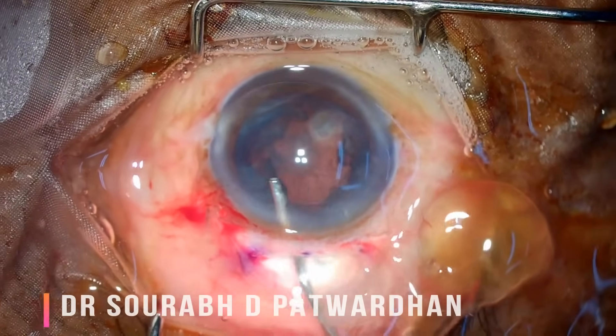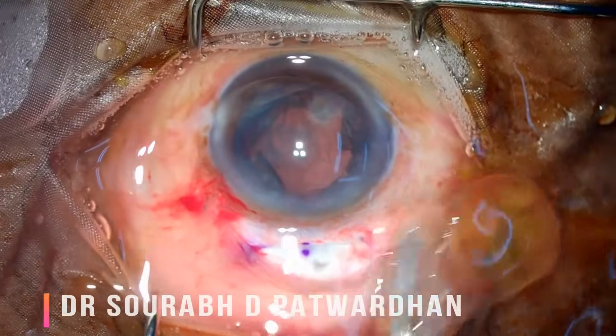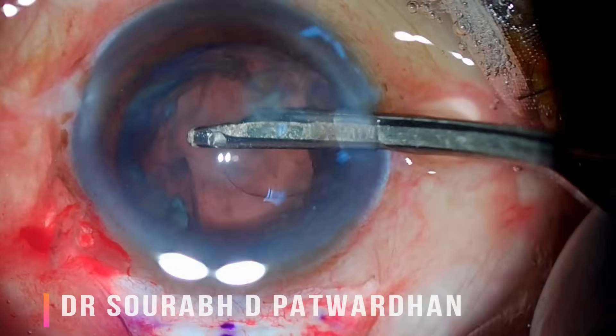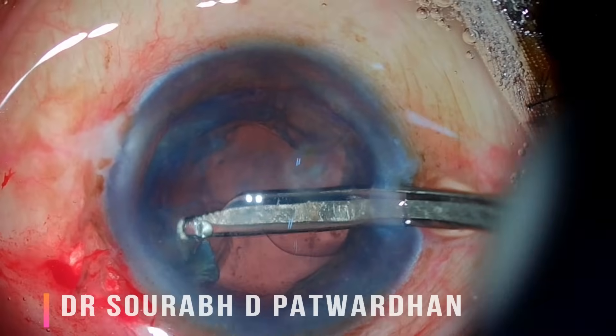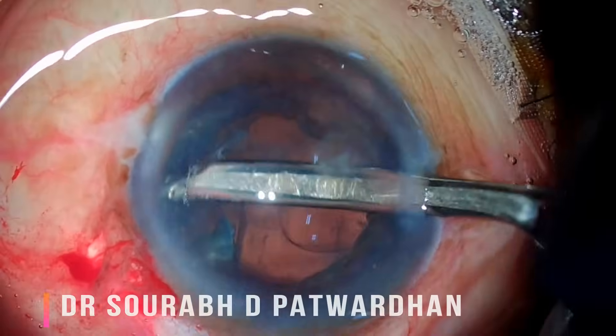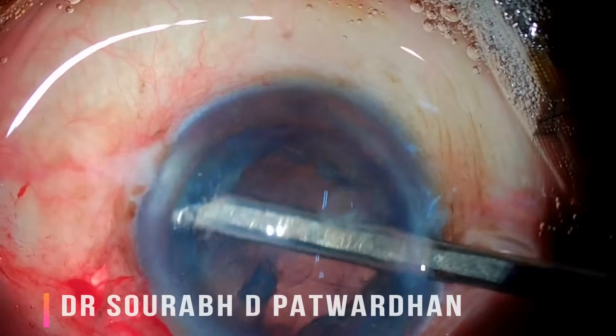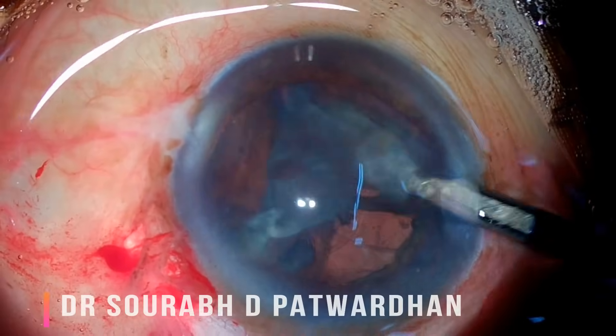If the nucleus is large, such as in cases of brown or black cataracts, you can make posterior extensions to the scleral incision to enlarge it on the outside for easier delivery of the nucleus, which I can demonstrate in another video.